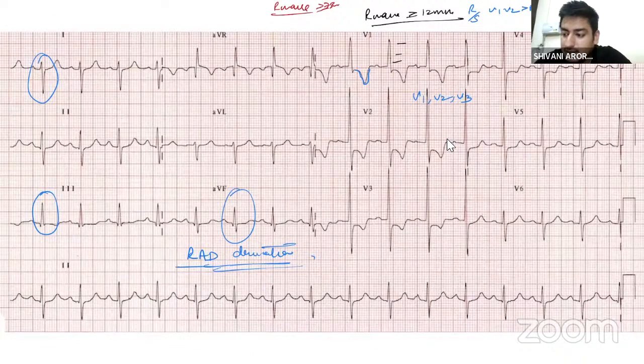Now next slide. So in this slide we will discuss about bundle branch blocks. So the first discussion would be about left bundle branch block.